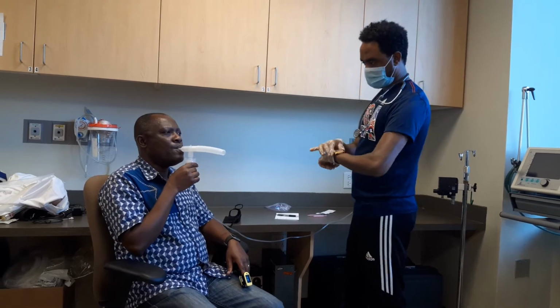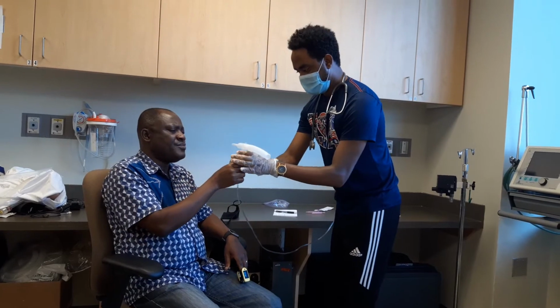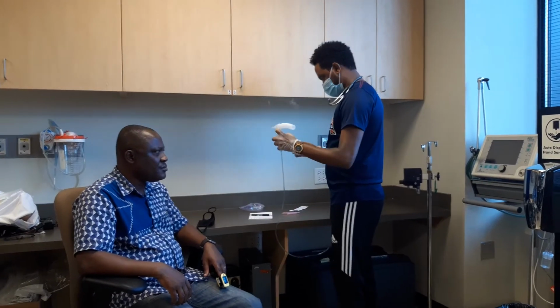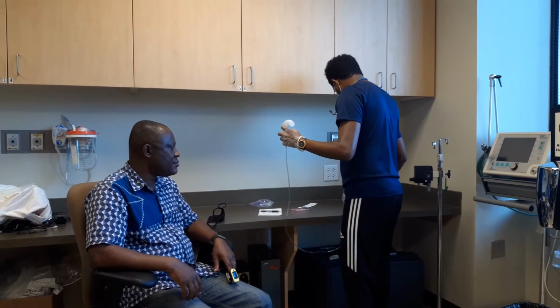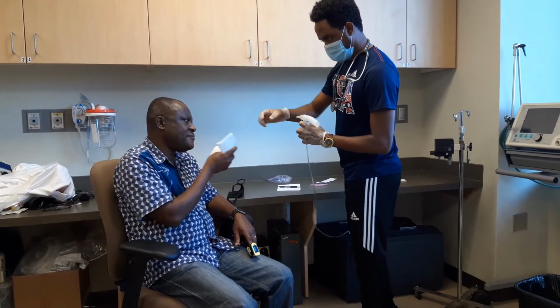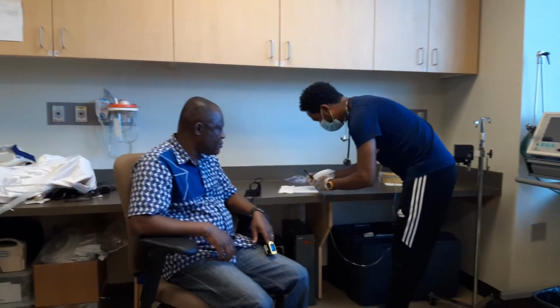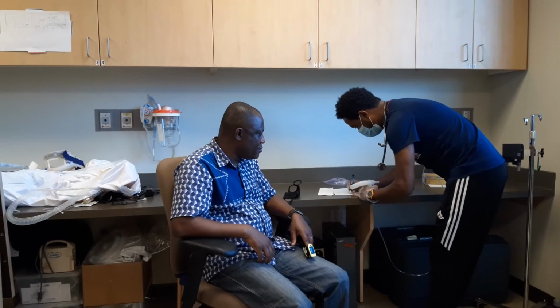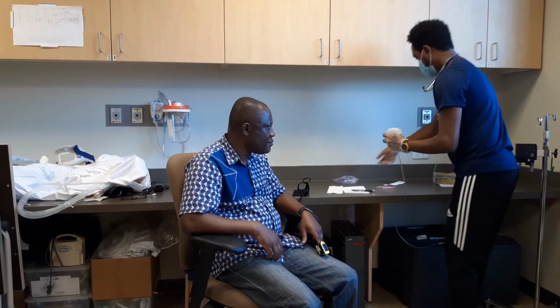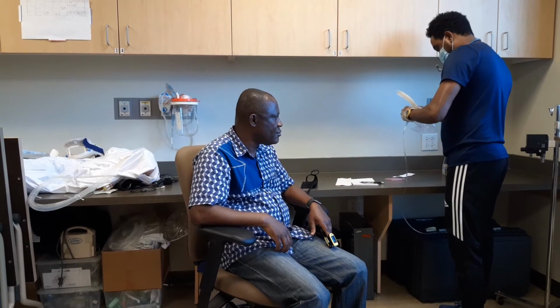Alright, it's almost 20 minutes, and all the medication is used. Okay, can I have it? Remove the oximetry. Can you cap for me here? Supplies go in their place, so they will be used every 4 hours.